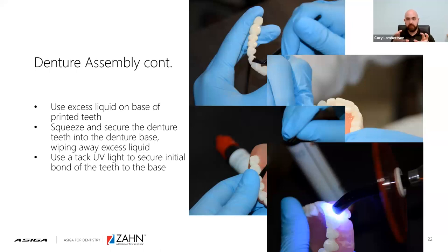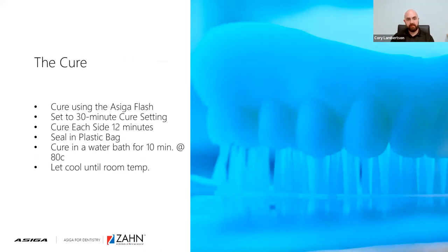This is not the final permanent cure — you cannot deliver to the patient, and should not proceed to polishing and characterization at this point. This is simply setting the teeth to the base. Once you have the teeth set in the base, you'll place the fused parts inside the Asiga flash curing unit. Set the timer to 30 minutes — on the back of the unit there are three timers: two minutes, three minutes, and 30 minutes. You're going to cure the denture a total of 12 minutes on each side. After that, seal the denture into a plastic bag and place it into a water bath for 10 minutes at 80 degrees Celsius. Once that 10 minutes is up, let the denture cool completely before handling.